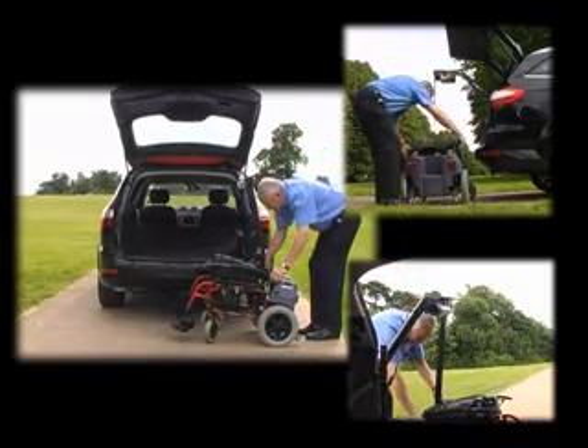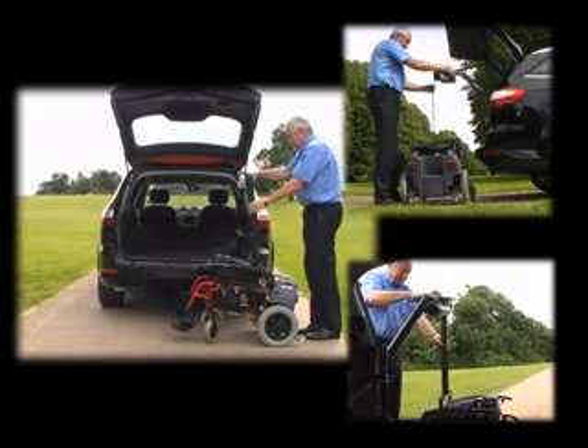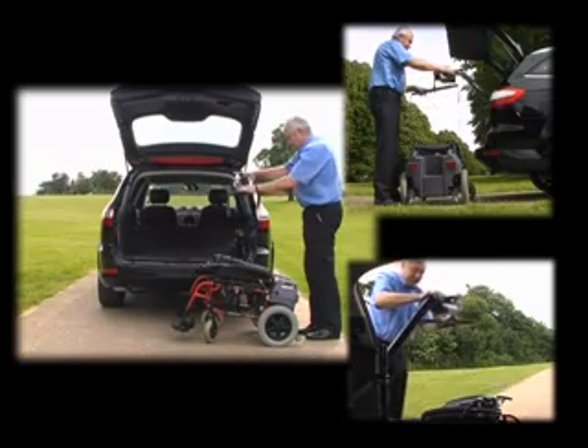The control box, incorporating the up-down switch, is mounted at the top of the lifting arm so the operator has full control of the hoist and wheelchair at all times.